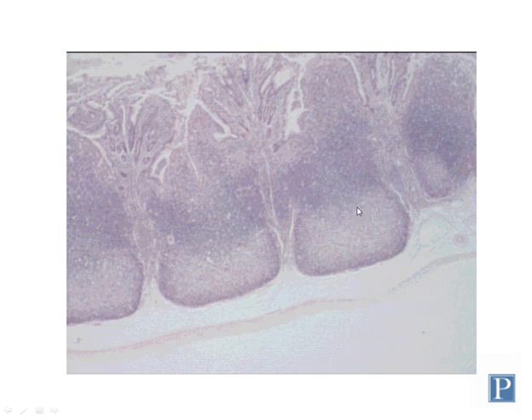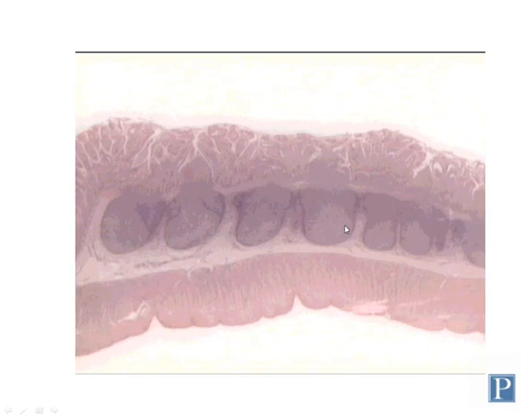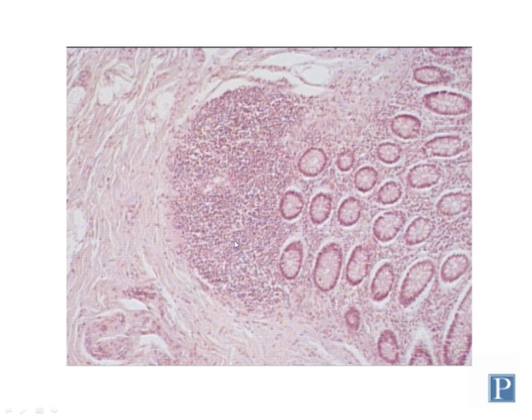And when a lymphoid nodule possesses a germinal center, we refer to it as a secondary lymphoid nodule. So make sure you know that term. These are all secondary lymphoid nodules that can be found in Peyer's patch within the ileum. Let me go back a couple slides. This solitary lymphoid nodule in the colon would be classified as a primary lymphoid nodule because it lacks a germinal center.